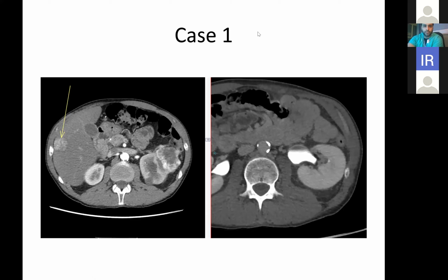Yeah, I've got a very simple question. I just wanted to ask, on the basis of images, on the appearance, how can we differentiate between a mass, a cyst, a collection? So is it heterogeneous or what? Yeah, so the question is, how do you differentiate between a solid mass versus a cyst? Is this based on CT or ultrasound?